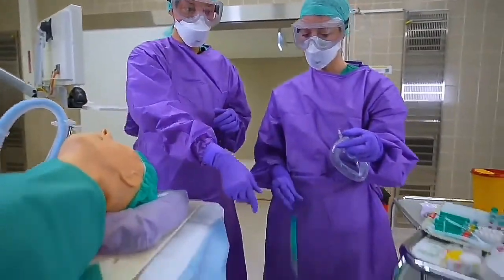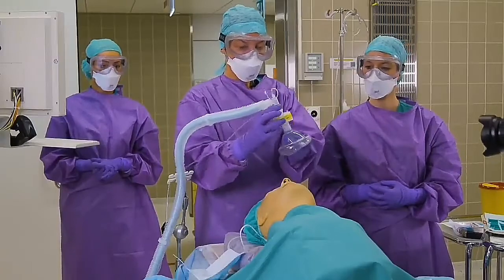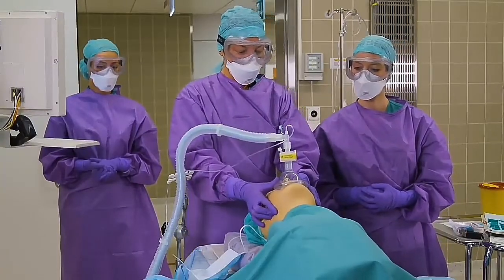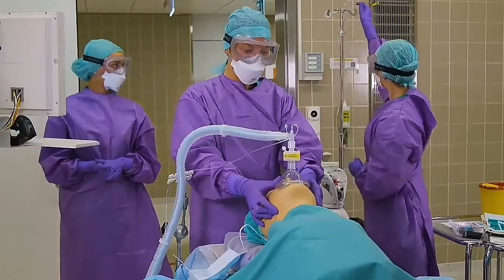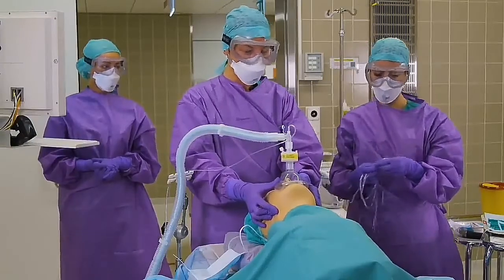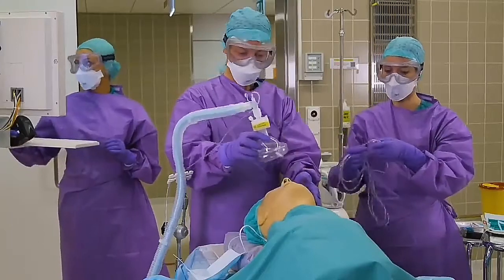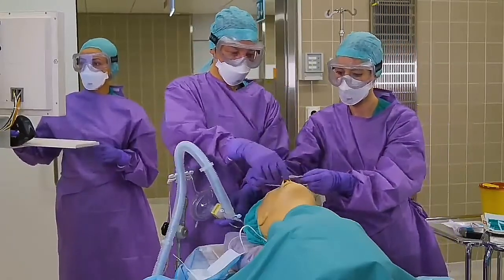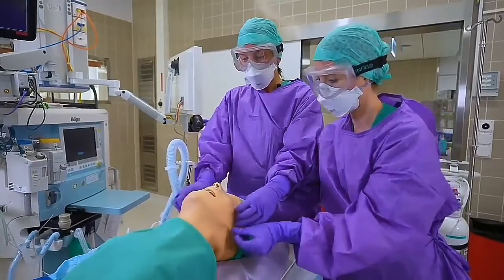We dispose of the tube right away and oxygenate the patient with a tight-fitting mask. Once the patient is adequately breathing, we are utilizing nasal prongs for transport. After the nasal prongs are on, the patient will also receive a surgical face mask.